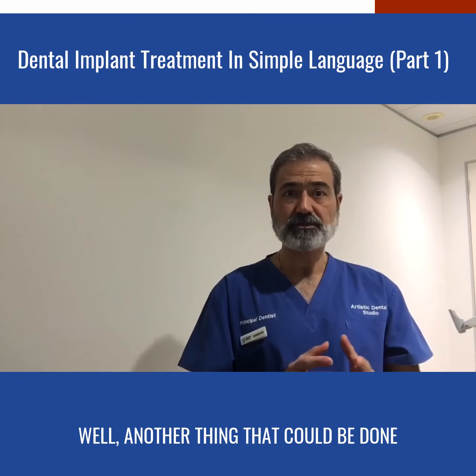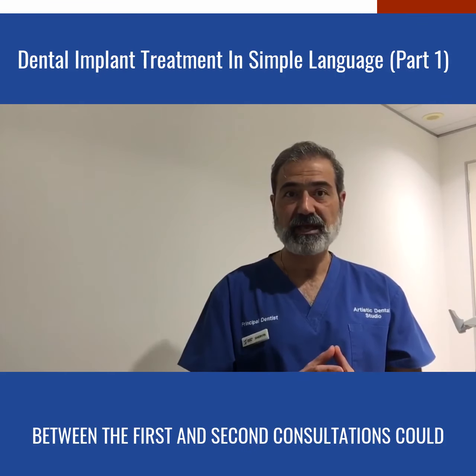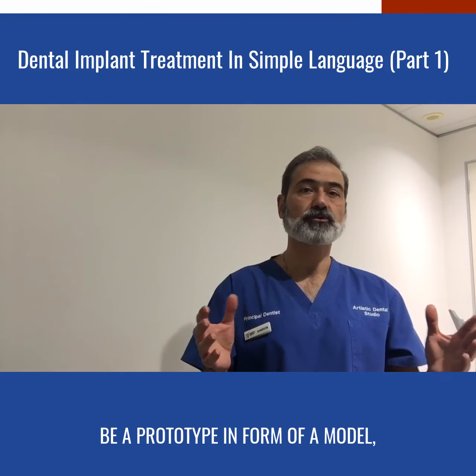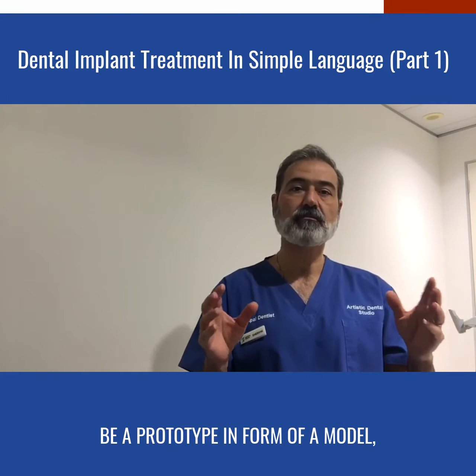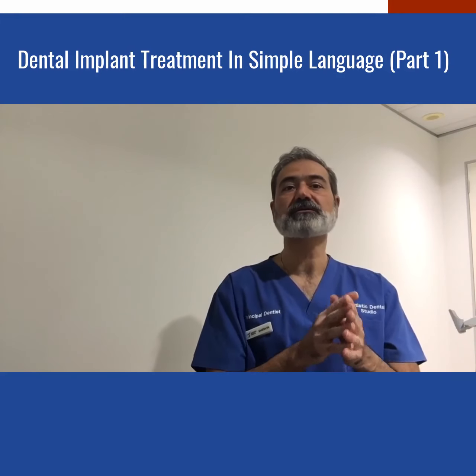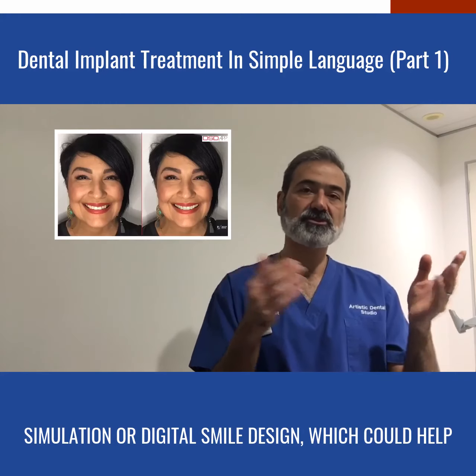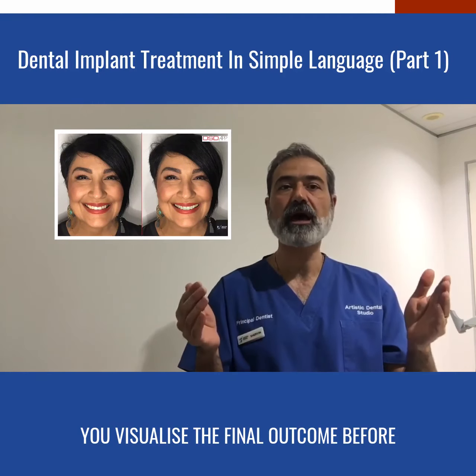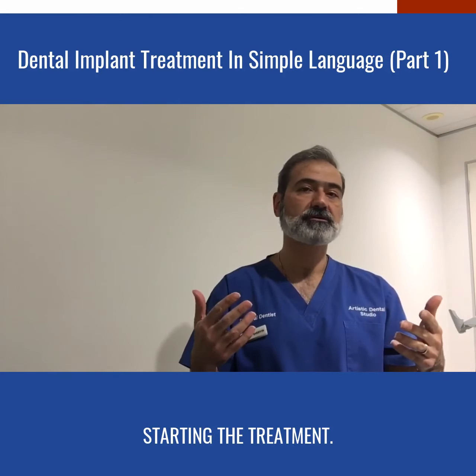Another thing that could be done between the first and second consultation could be a prototype in the form of a model, which is a wax up, or a virtual smile simulation or digital smile design, which could help you visualize the final outcome before starting the treatment.